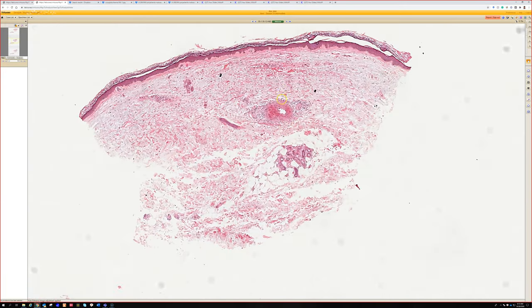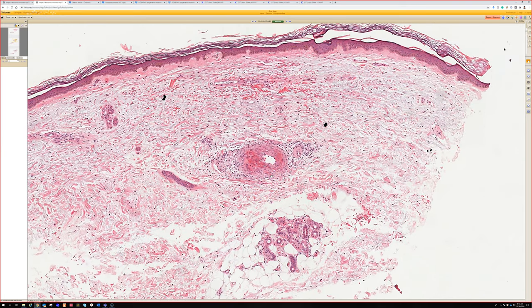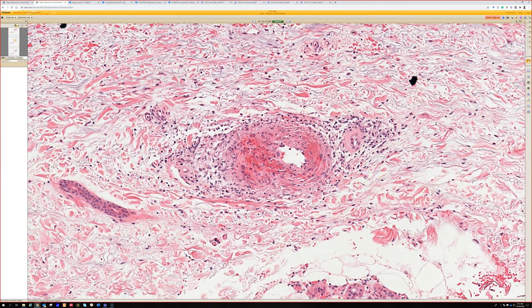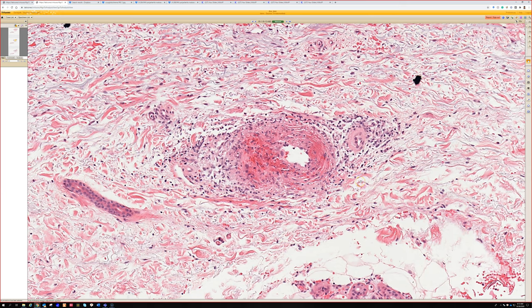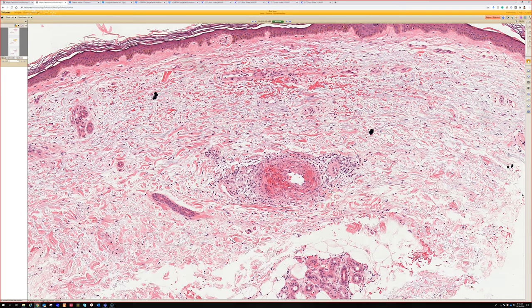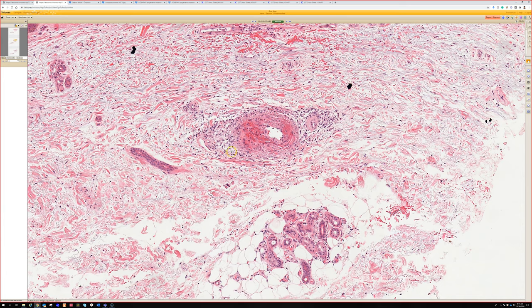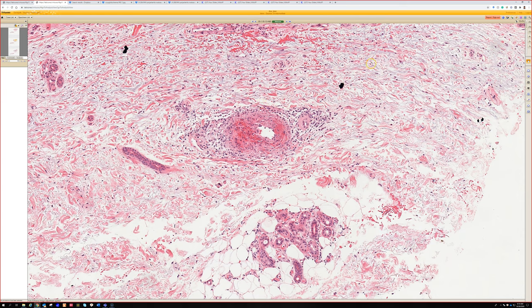Case 12. The first thing that jumps out is a medium-sized vessel with a lot of the features you think of for vasculitis: RBC extravasation, karyorrhexis, neutrophils, fibrin, and that kind of stuff. It doesn't have a significant superficial small vessel component, so maybe you can think more of the medium vessel vasculitides like polyarteritis nodosa. This is the smallest example of polyarteritis nodosa that I've seen actually — usually the vessels are a good bit bigger. It's one vessel — it doesn't have small vessel vasculitis up here — and it's kind of near the dermal subcutaneous junction.